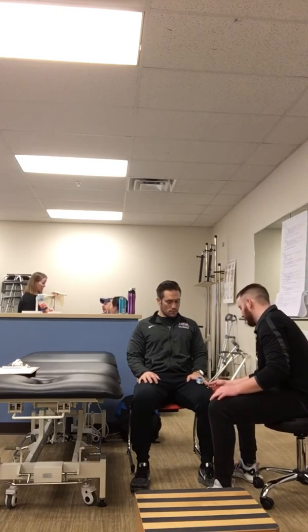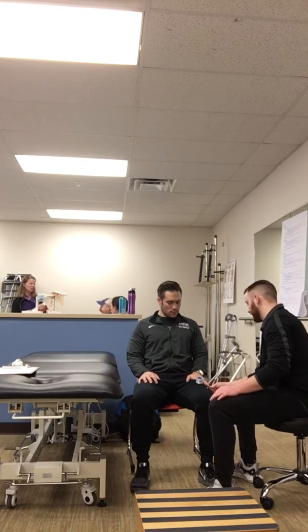Same thing, I'll be watching the respiratory rate again, seeing if he was in that healthy range as well. Also expecting a slight increase just because of some activity. And now same thing, fingernail, making sure oxygen is still flowing through the body even with activity. And then post-activity, you always want to monitor and see if their vitals can return back to normal.